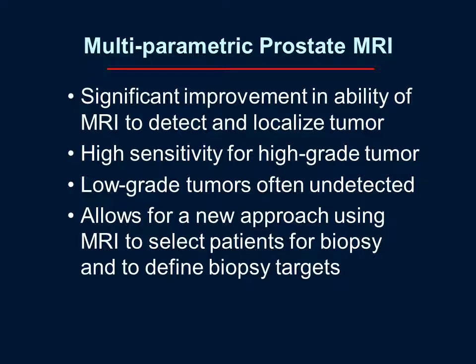There has been significant improvement in the ability of MRI to detect and localize tumor within the prostate over the past decade. Now, with current protocols, MRI has consistently high sensitivity for high-grade tumors, with low-grade tumors often being undetected. So this now allows for a new approach using MRI to select patients for biopsy and to define the biopsy targets.